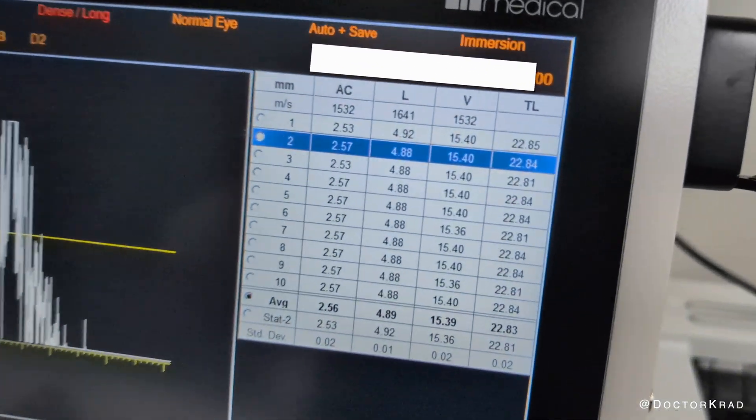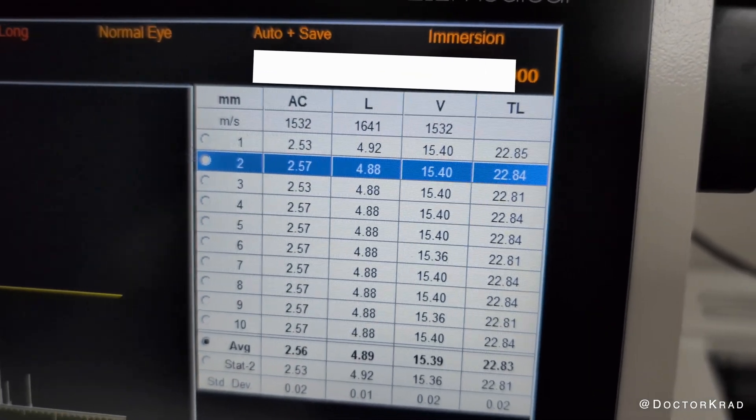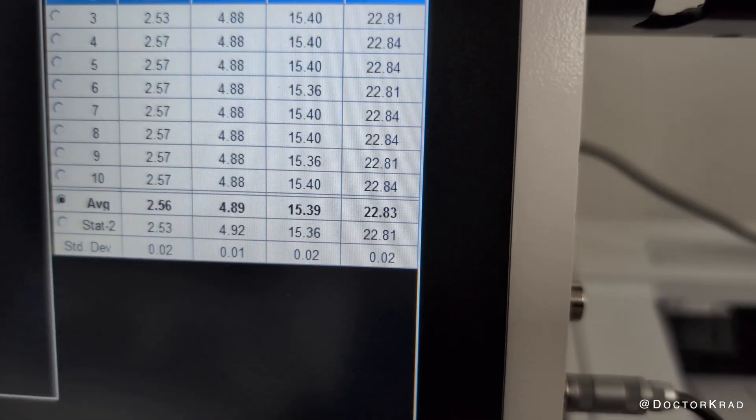You can open your eyes. So now I have 10 readings, and it shows me the anterior chamber depth, lens thickness, vitreous length, and total length of the eye, and it gives me an average.